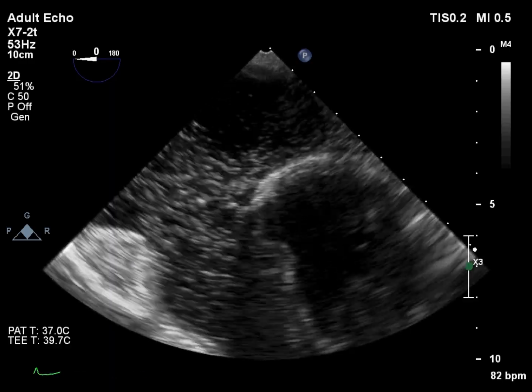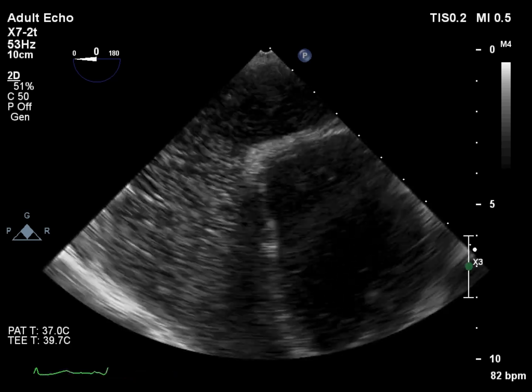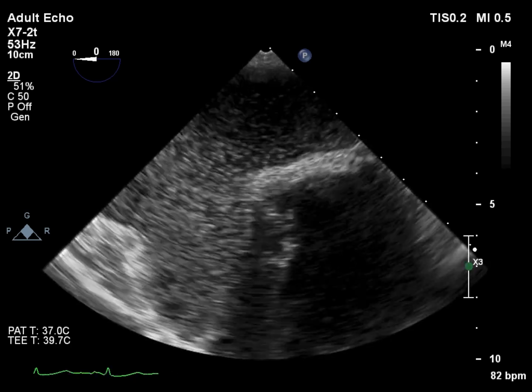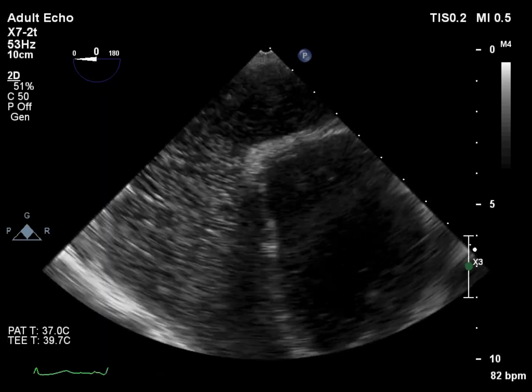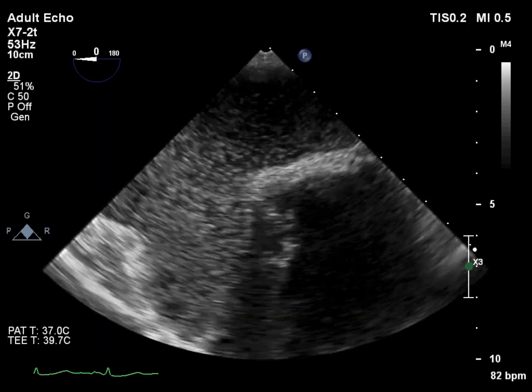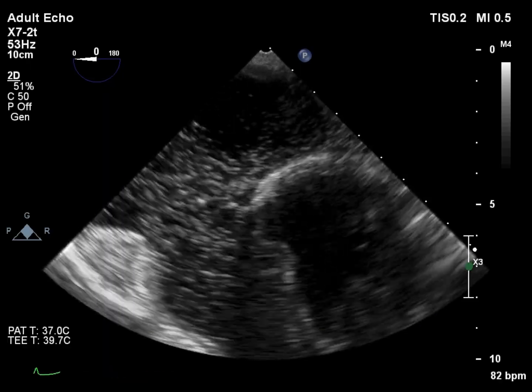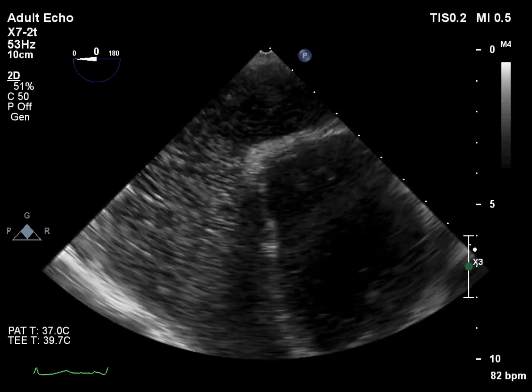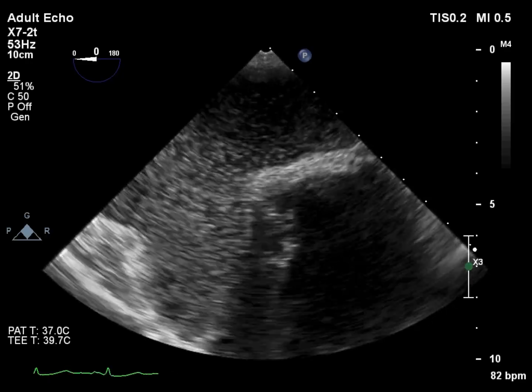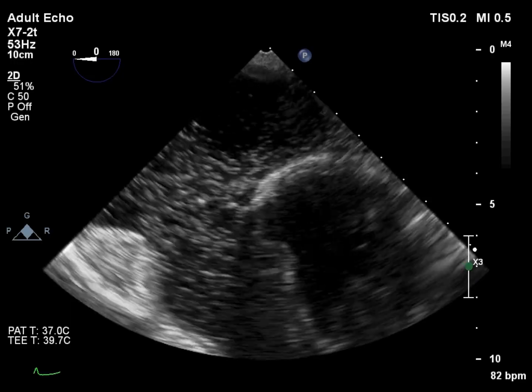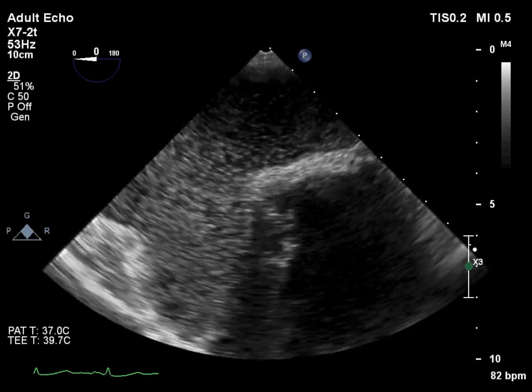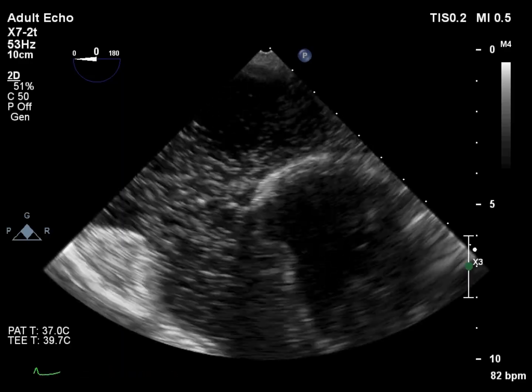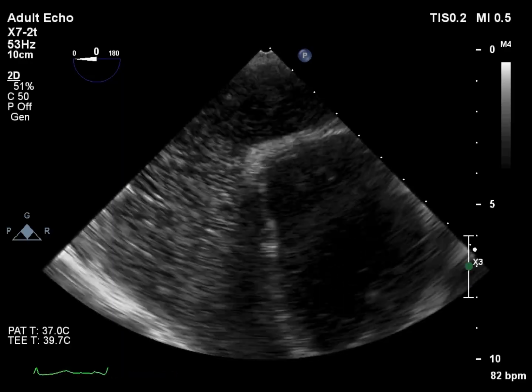This shows a dilated coronary sinus with agitated saline injected into the left antecubital vein, which drains through the coronary sinus. This is indicative of a persistent left SVC. In fact, the left SVC, which should have obliterated during embryonic development, is draining directly into the coronary sinus, causing its dilation.